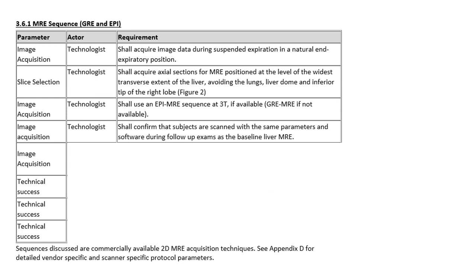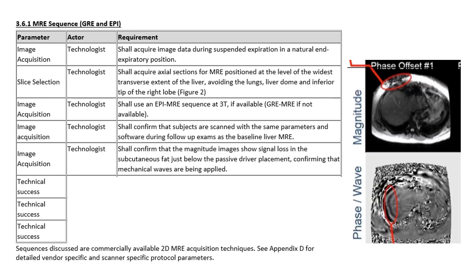The technologist should also confirm that the subjects are scanned with the same parameters and software during follow-up exams as the baseline liver MRE whenever possible. The technologist shall confirm the magnitude images show signal loss in the subcutaneous fat just below the passive driver placement. This confirms that the mechanical waves are being applied.